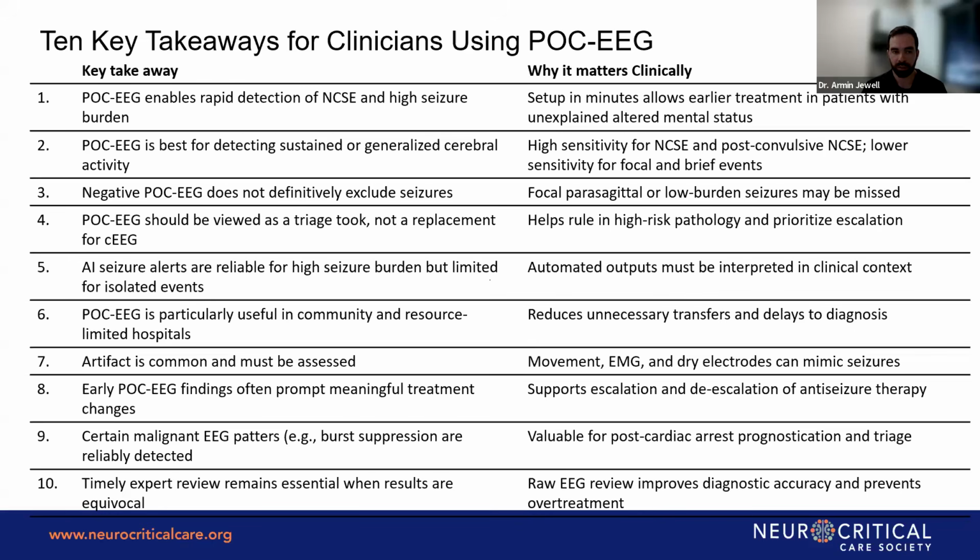Artifact is a common part of both types of EEG, as well as this EEG technology. Early application of this can prompt meaningful treatment changes. As I mentioned, if you're able to see ongoing seizures quickly, then you're able to treat quicker. There were certain EEG patterns that are detected as well with continuous and point of care EEG, especially when it can be placed for a long term, so for post-cardiac arrest prognosis, et cetera. And the physician review is important.